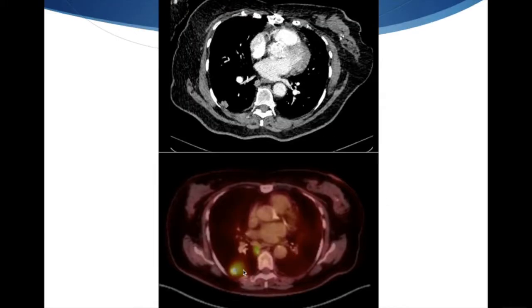Here's another case with a small peripheral lung lesion which on the PET scan is highly avid or highly metabolically active. You can see a little bit of faint yellow tucked right in there and that corresponds to this node here. This is a paraesophageal lymph node — not very commonly involved in lung cancer — and it's very important to biopsy that to see if it's a metastasis. The esophagus sits here, so using the linear EBUS in the esophagus we'll be able to biopsy that lymph node.